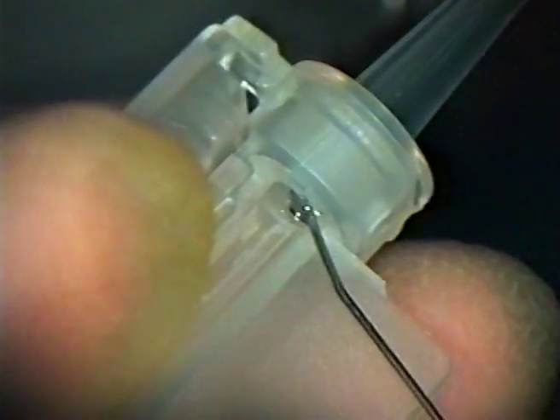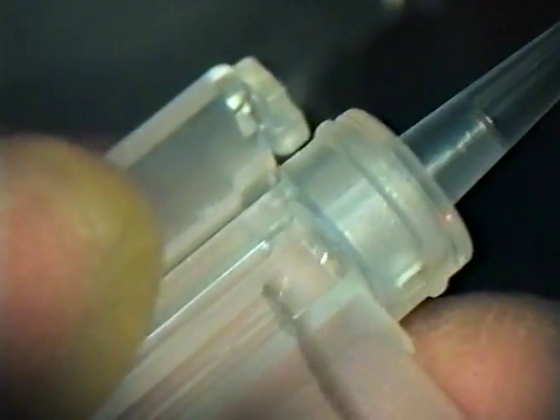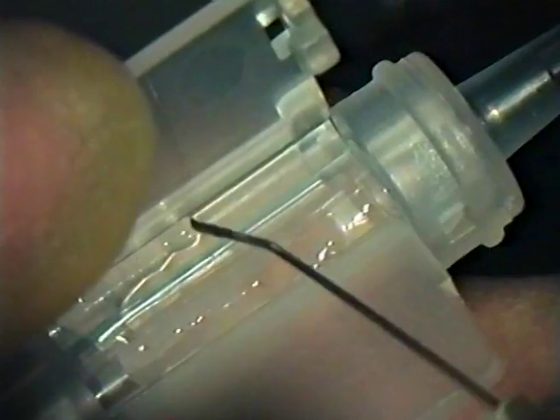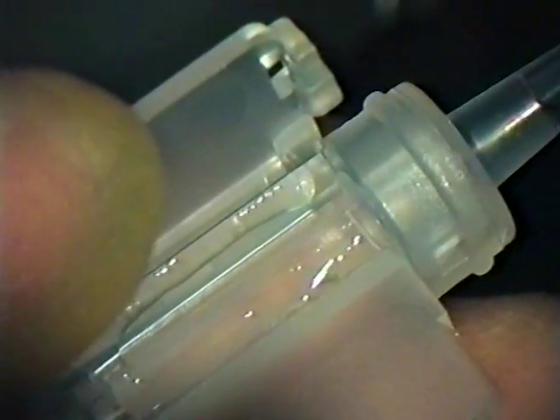After phacoemulsification and cortical cleanup, a suitable ophthalmic viscosurgical device is used to inflate the capsular bag and lubricate the injector loading bay and nozzle.